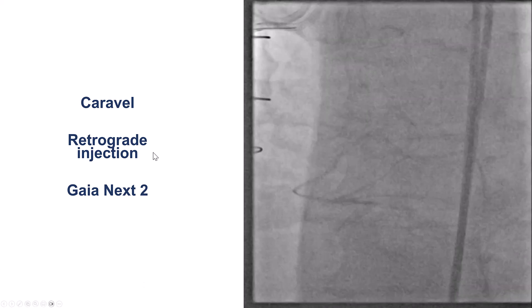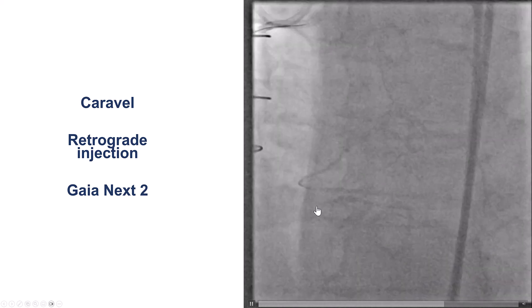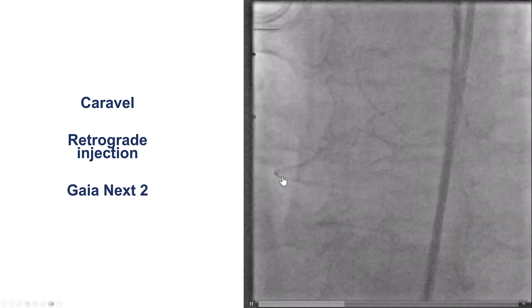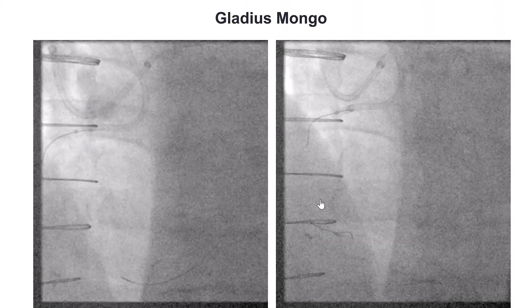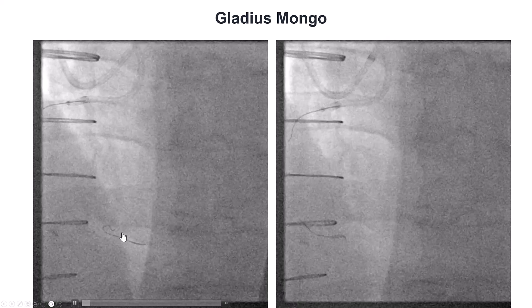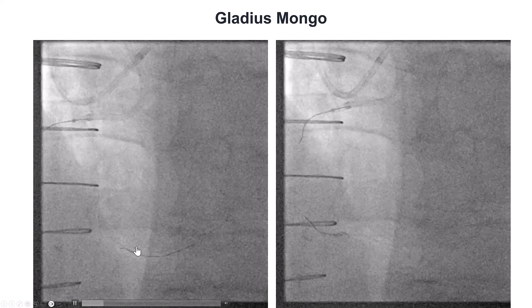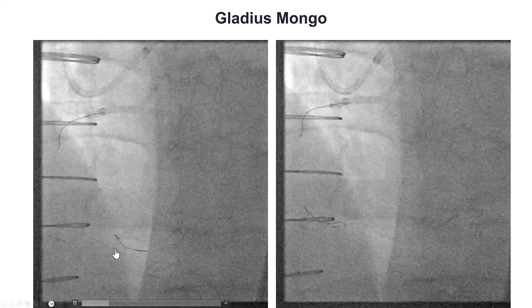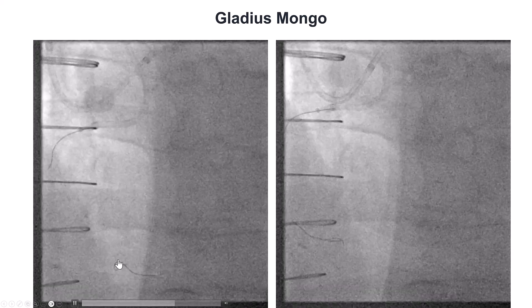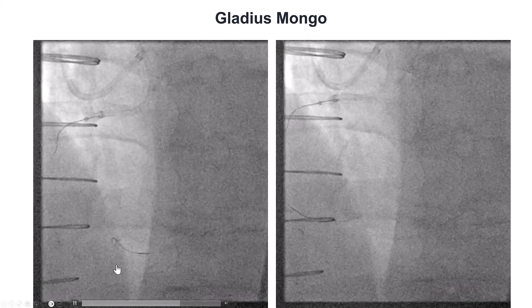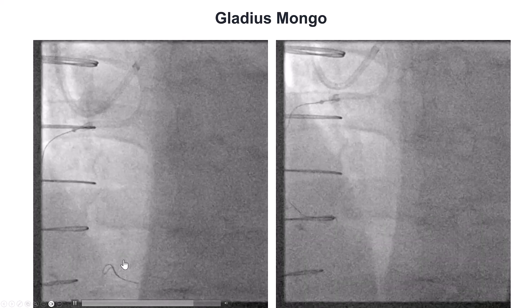After that, we delivered the Caravelle microcatheter. We did an injection that shows a CTO at the distal cap, at the distal bifurcation of the PDA and the right posterior lateral. We used a Gaia Next guide wire to advance the microcatheter slightly into the occlusion, and then we switched to a Gladius Mongo. We did have difficulty with the Mongo trying to go back into the posterior lateral, but eventually, after multiple attempts and repositioning, we were able to advance the knuckle inside the distal right coronary artery.